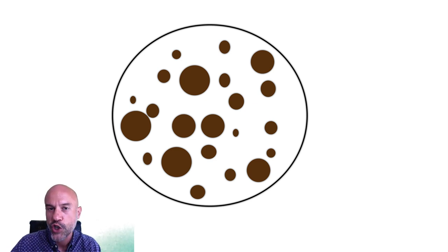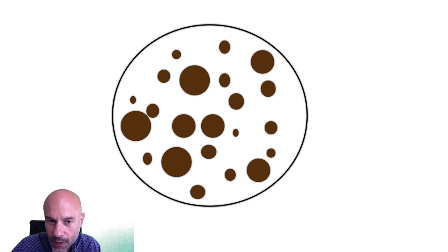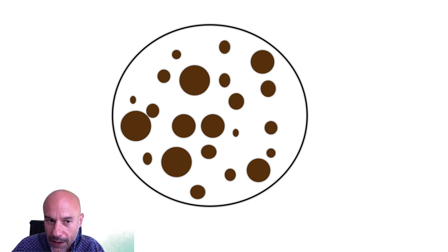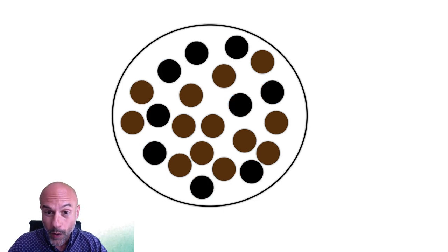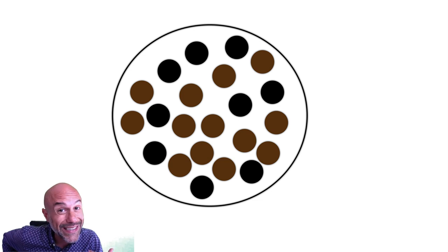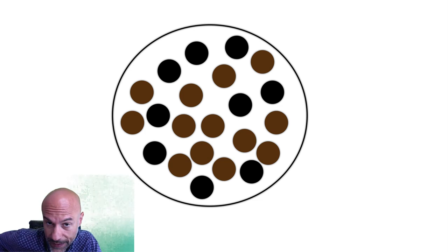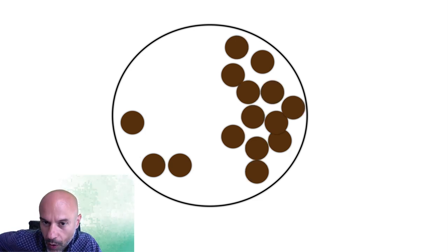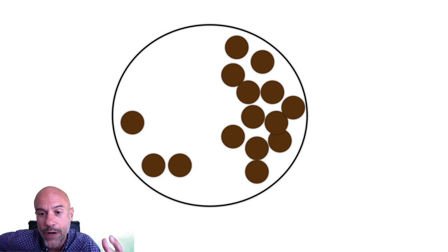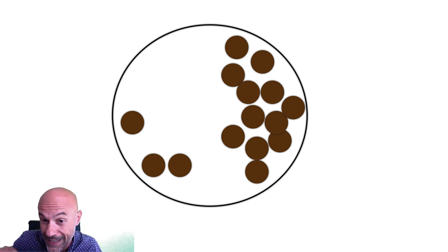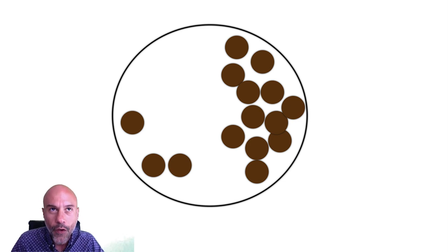Now if we look at this example, the answer changes — these globules are irregular. Why? Because we see globules of different diameter, some large, some smaller. Or in the next example: same diameter but different color, which makes them irregular. Or in the next example: same color, same diameter, but not regular distribution — many globules aggregated on the right part and very few on the left.